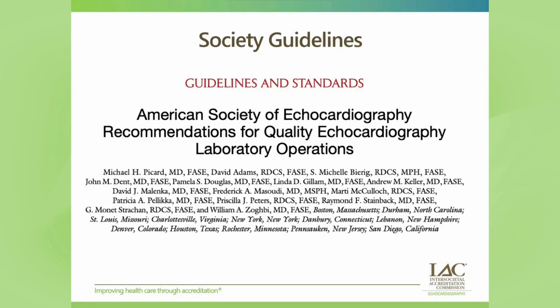The American Society of Echocardiography published recommendations for quality echocardiography laboratory operations in 2011 with the intent to provide a framework for our quality assessment and improvement within the Echo Lab. Their goal was to highlight general recommendations for minimum quality standards, focusing on the process of clinical echocardiography, including our Echo Lab structure and imaging process. Referencing Douglas et al., ASE states imaging process can be further separated into 5 areas that may influence patient outcomes. They include patient selection, image acquisition, image interpretation, results communication, and then they add the incorporation of results into care. In all of these domains, we do have distinct benchmarks of quality that can be established.